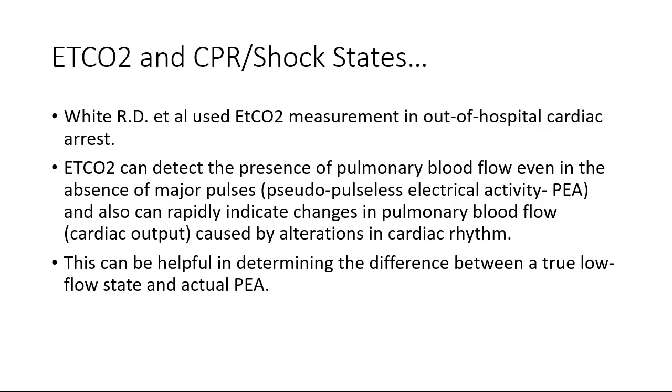If you're cooking along, doing CPR, and you have your end-tidal CO2 and tube in place, and your end-tidal CO2 is at 20, and suddenly it jumps up to 40 or 50, that's a good thing. It means you're about to get pulses back. The opposite is also true.